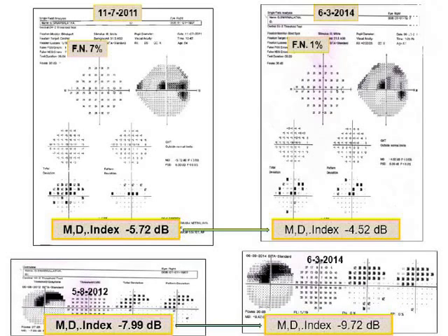So the most important thing is the fundus examination. If you go on concentrating on the fundus examination, you can find cases like this. Even in the left eye, the left eye is not showing progression in 24-2, but here the left eye started showing it in 2012. Almost this is the scotoma in 10-2, but they are increasing.